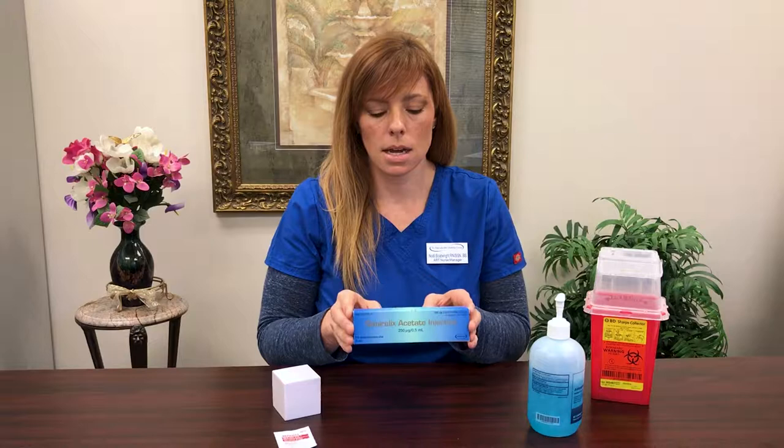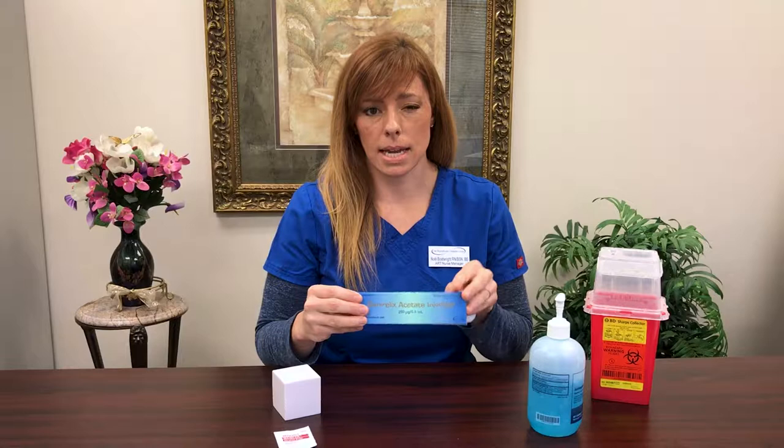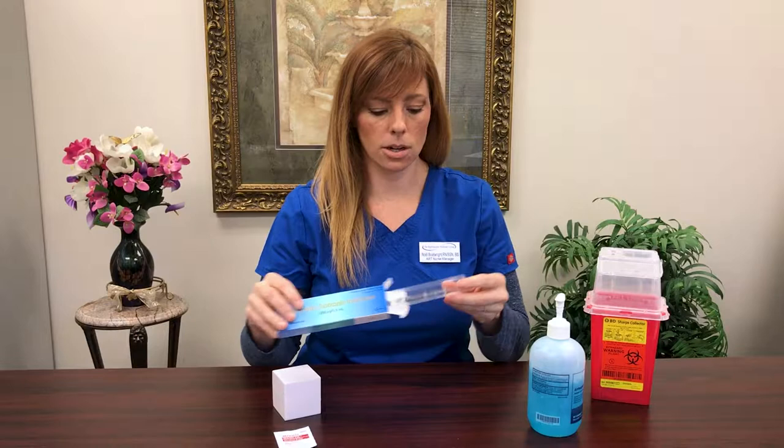The cool thing about Ganorelix is it comes in a pre-filled syringe. It's one of the easier medications to give and it should be fairly straightforward. So in your box, you're going to find another box, and that box is going to be sealed with your pre-filled syringe.